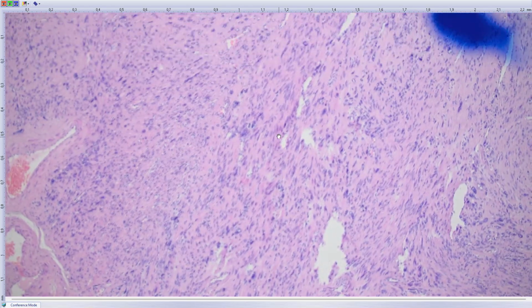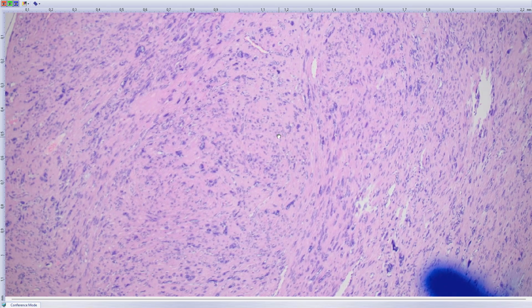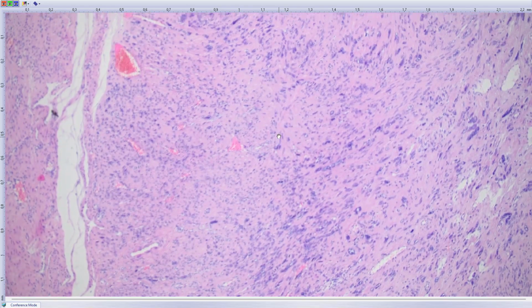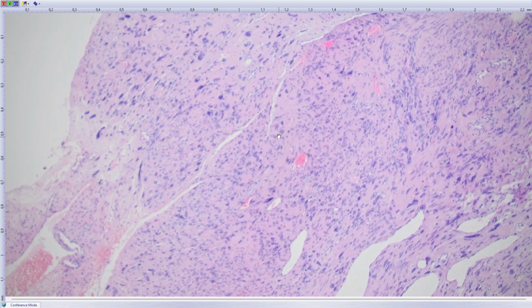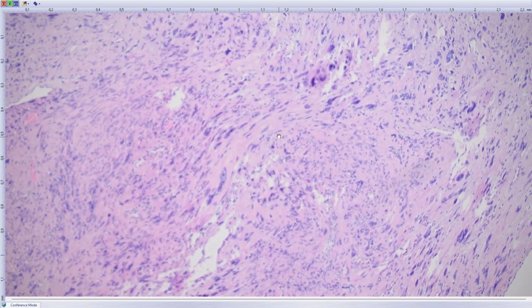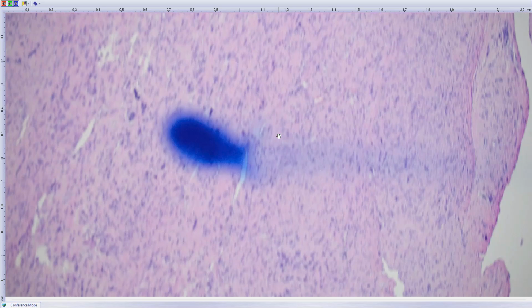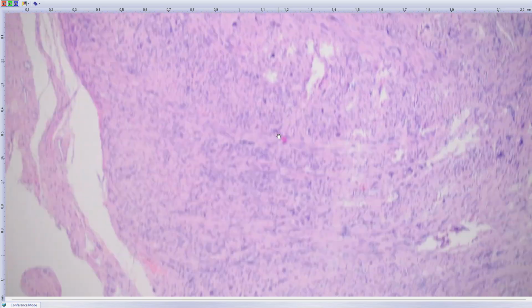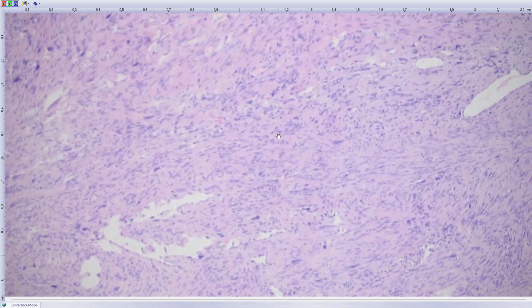But if you want to search for other aggressive histological features such as mitotic activity, infiltrative growth, presence of tumor necrosis, and maybe others, atypical mitosis, there were none of these features throughout the whole tumor. So this is a quite typical example of a well-known lesion called leiomyoma with bizarre nuclei.